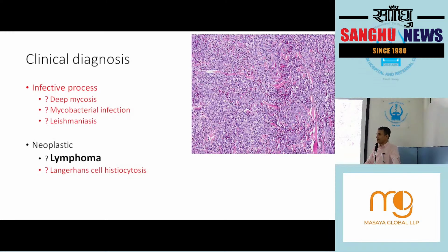Now you see, I'm lost now. I'm lost. And along with me, dermatologists are also lost, because they are not getting a diagnosis. They are worrying about the patient. How should they manage the patient? And I am left with only one diagnosis: lymphoma, because LCH is ruled out. LCH is less likely.